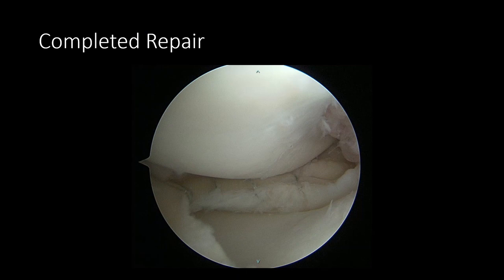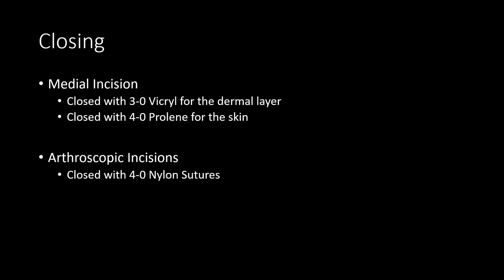A microfracture awl was used in the notch to induce healing. The medial incision was closed in the standard surgical fashion with 3-0 Vicryl for the dermal layer and 4-0 Prolene for the skin. The arthroscopic incisions were closed with 4-0 nylon sutures.